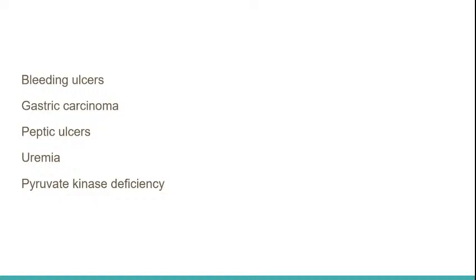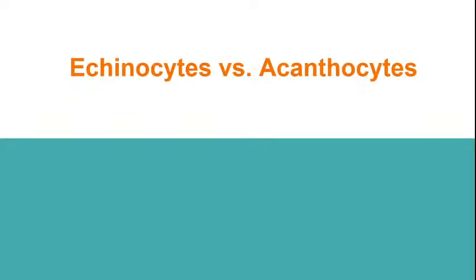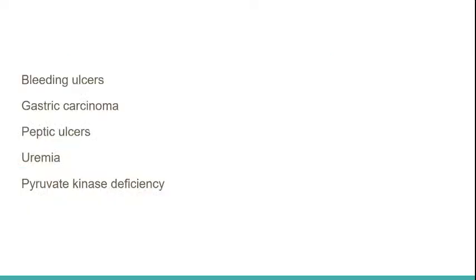But again, as I mentioned before, Burr cells are pathologic in nature, and crenated cells are artifactual in nature.